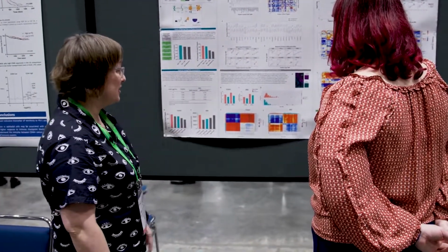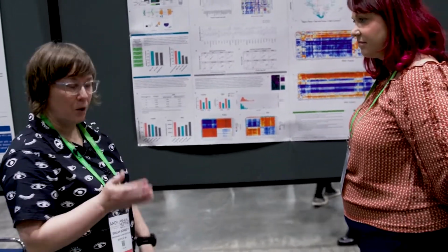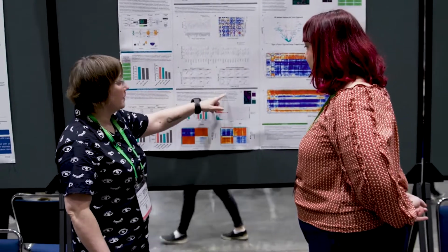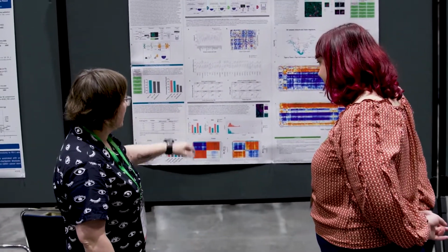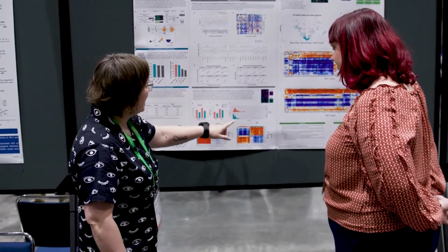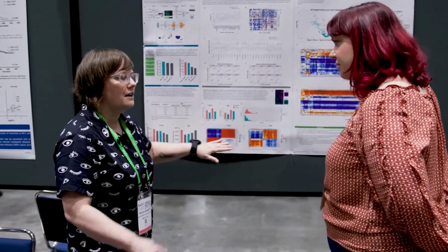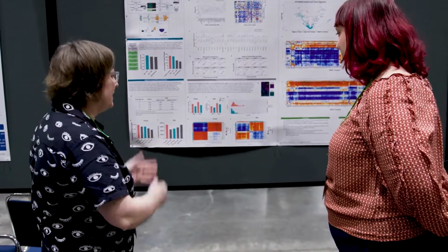But in the real world, we don't use cell pellet. We're all about tissue. So we tested on various types of tissues from disease to normal, and we just provided a single example for non-small cell lung cancer. Again, sensitivity is comparable. We do get a little loss, but a lot of that loss, as reflected in this histogram, is from low-expressing targets that are right at our threshold. So it's still there.